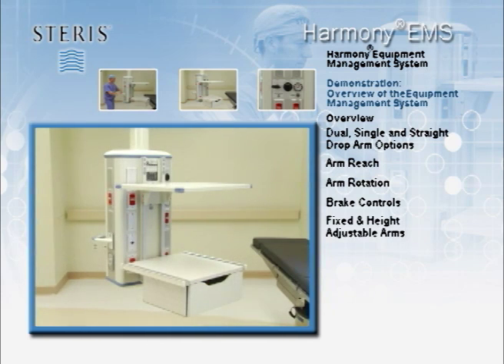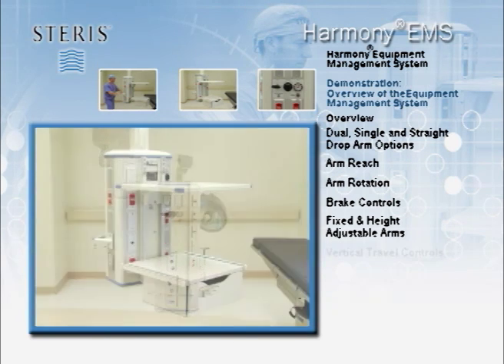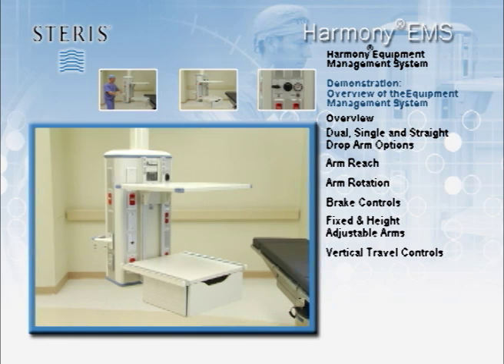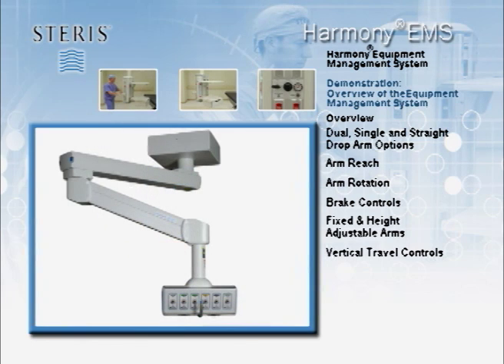Harmony EMS suspension systems can be configured with adjustable electromotorized arms or pneumatic spring arms. The vertical travel of the height adjustable suspension options is approximately 24 inches. To adjust the height of the electromotorized unit, press the up or down arrows on the left brake handle. The manual pneumatic height adjustment of the Easy Lift spring arm is accomplished by gripping the handles and raising or lowering the pendant supply head.